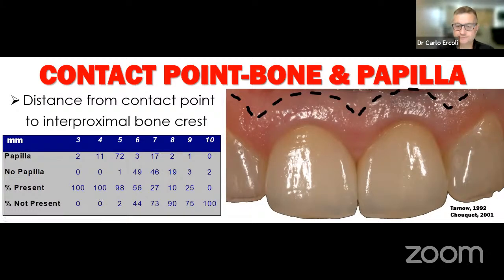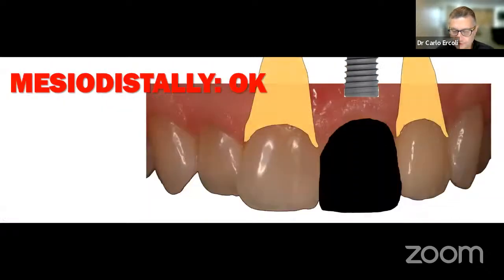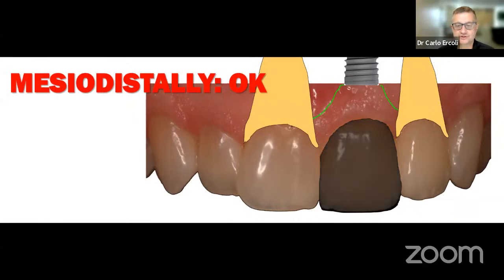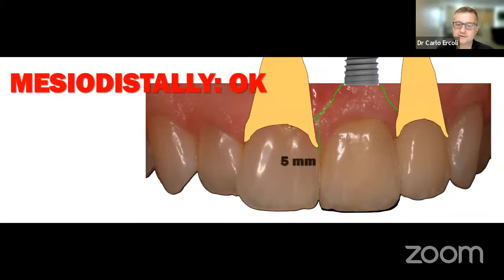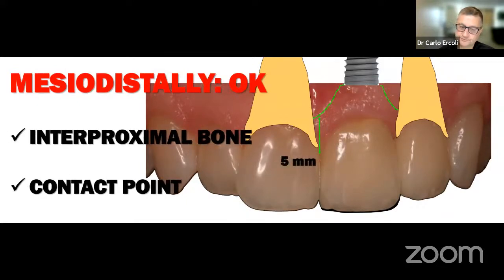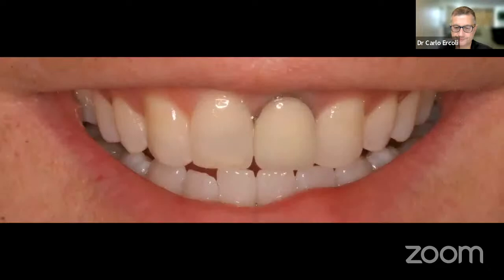So having said that, if your soft tissue is in the right place, and your implant is placed 3 millimeters below the gingival margin on the buccal, you may expect, again, that distance to be fully filled by soft tissue. Now here, what is important is the interproximal bone and the contact point. So both of them are important. You need to have both. You can't just have one of them.